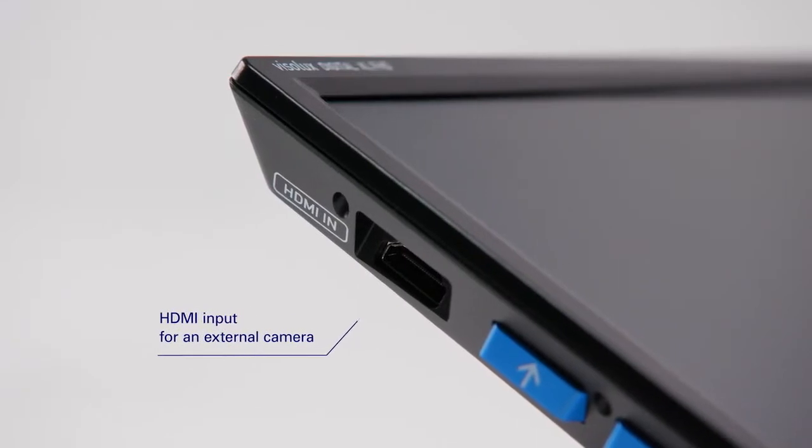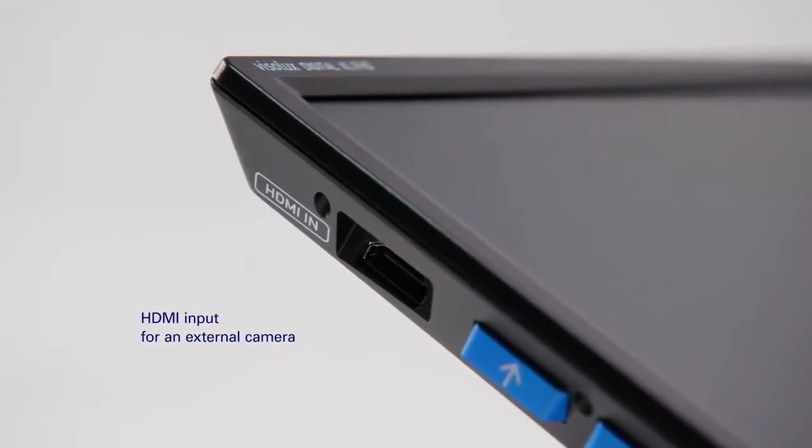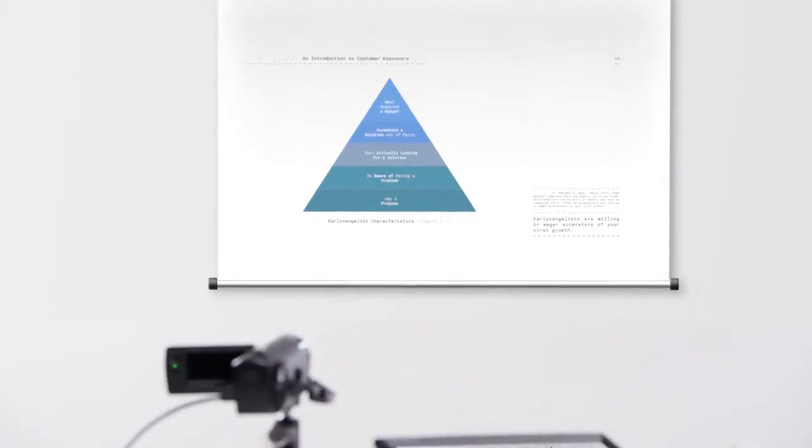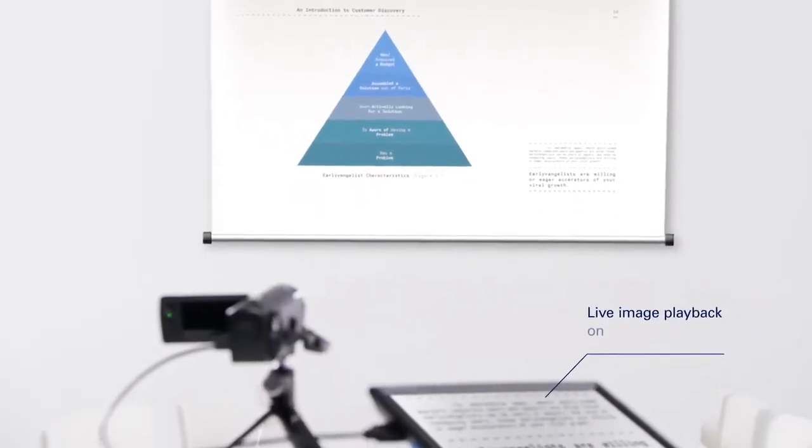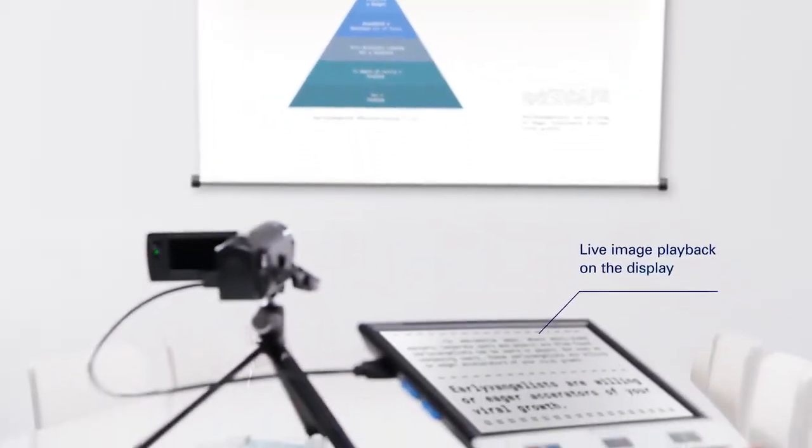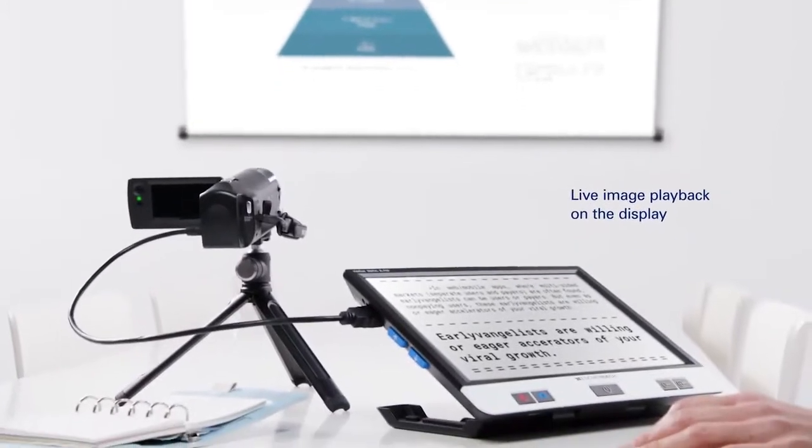An additional HDMI input allows you to view details of distant objects on the display using a camera.